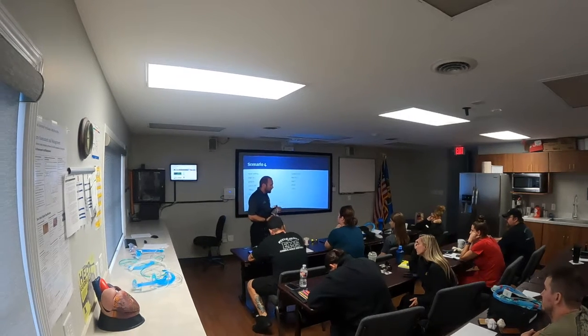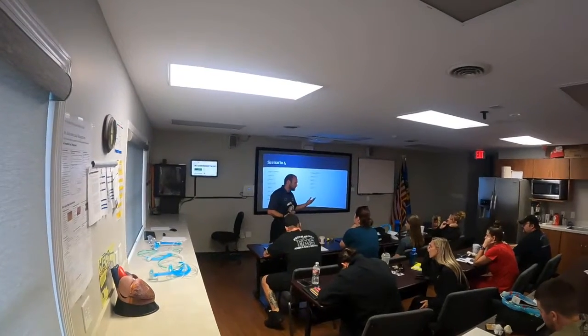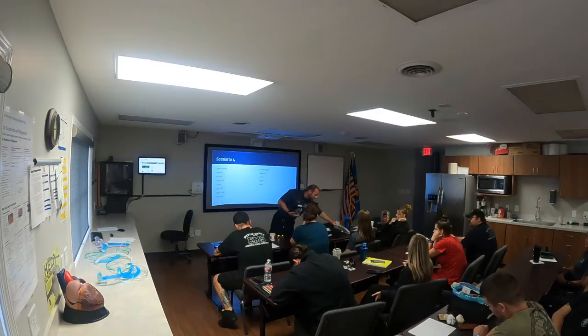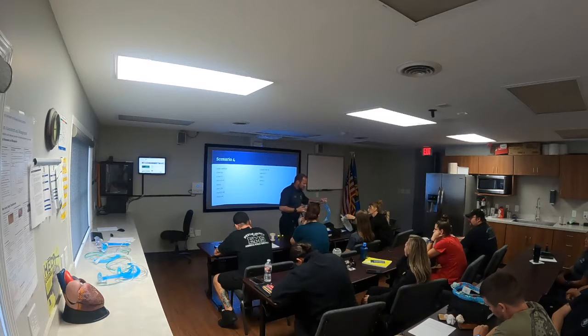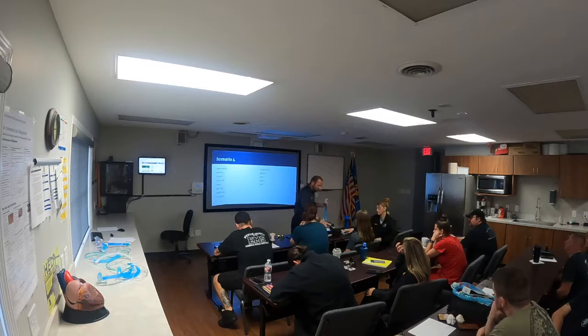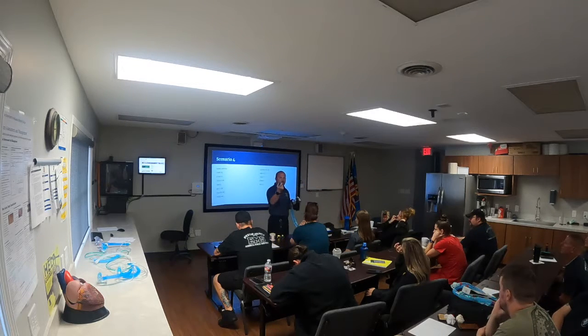So, I'll have you guys work right up here. We'll attach this. Okay, again, we are going to go to SIMV. Sorry, we're going to go and set up BiPAP. Someone bring the monitor up here, Keith.